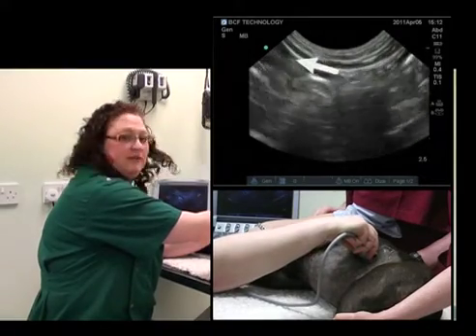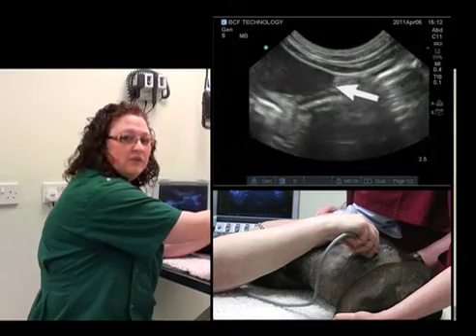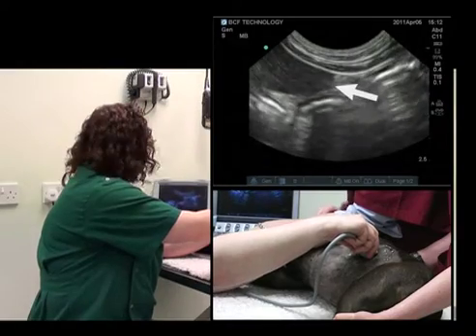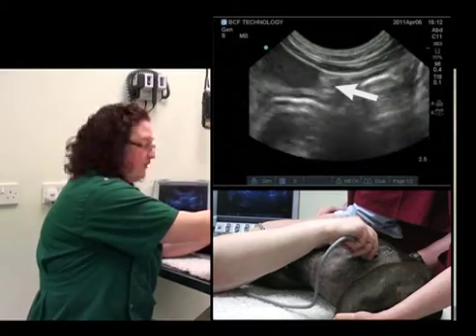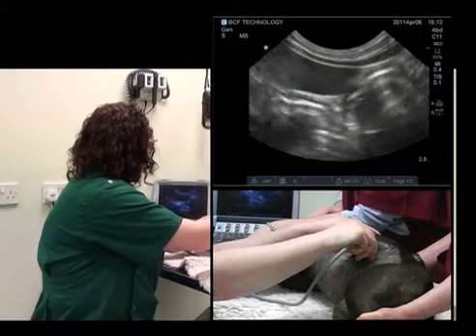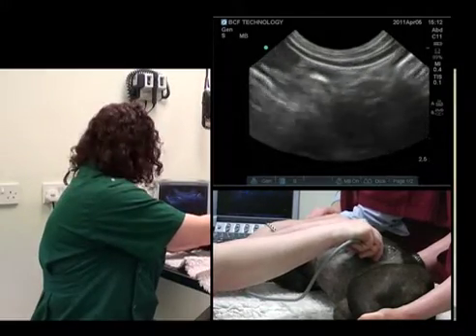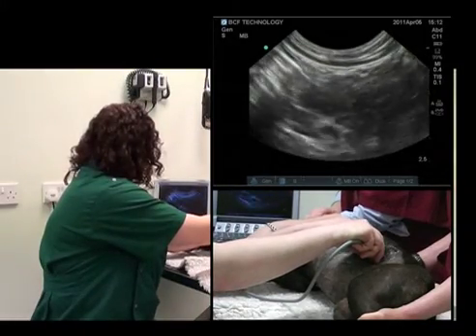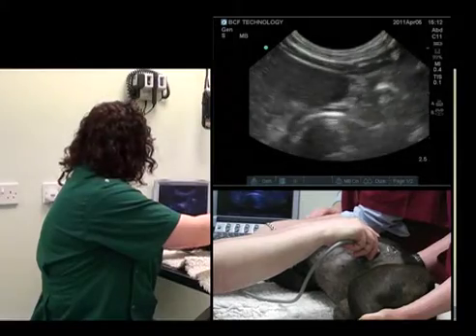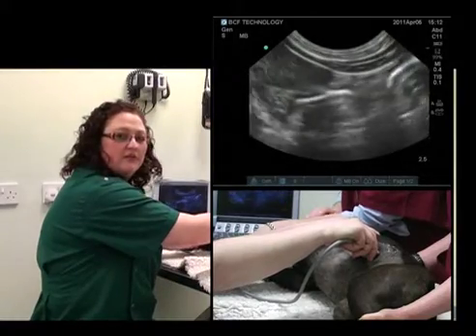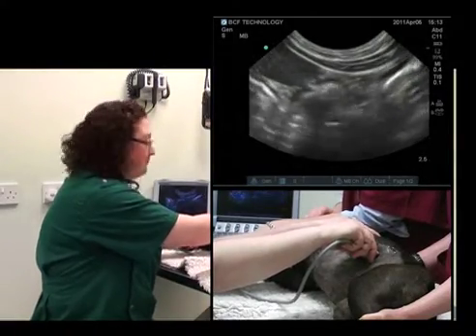If I release the pressure, the spleen comes back into view — it's on the left-hand side of the screen. If I apply pressure and then release pressure, the spleen comes back into view. So it's important to always bear that in mind.